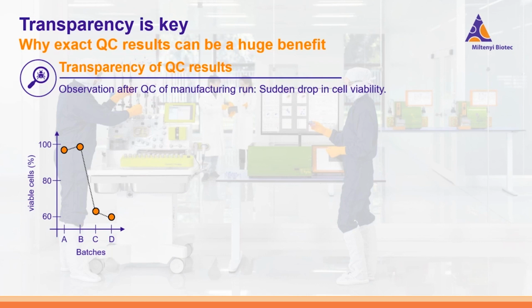And that is obviously worrisome, and that is not something you would like to see. And upon closer inspection, you now realize that batches A and B, where everything is okay, and batches C and D, where you have the problems with the viability, were actually produced with 2 different batches of cytokines.